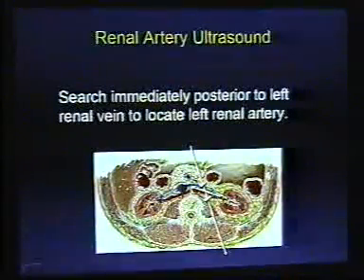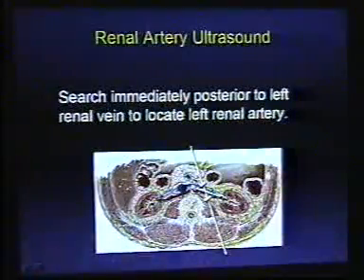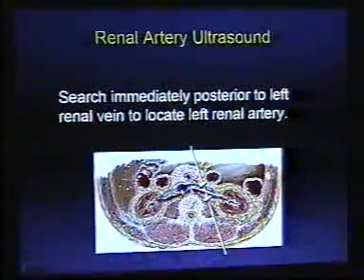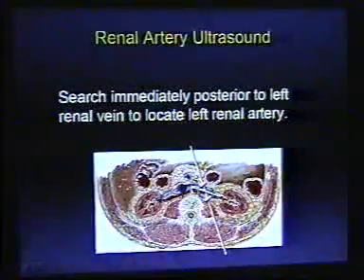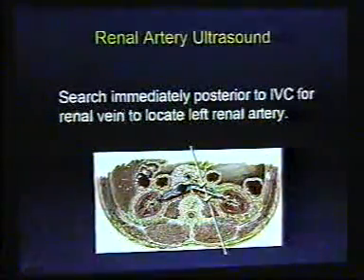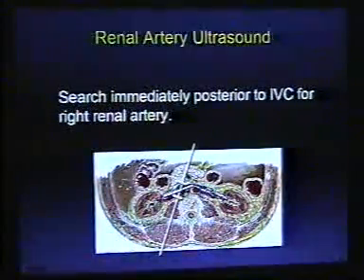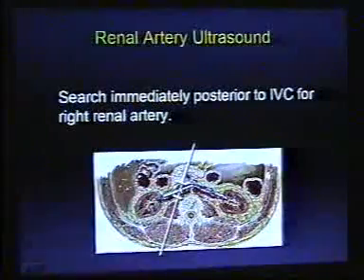You can see both kidneys, and then we have renal artery and vein. This is IVC and abdominal aorta, and we can see the renal vessels. We can assess abdominal aorta and the spectral flow at IVC.